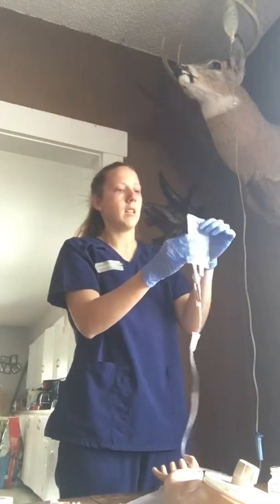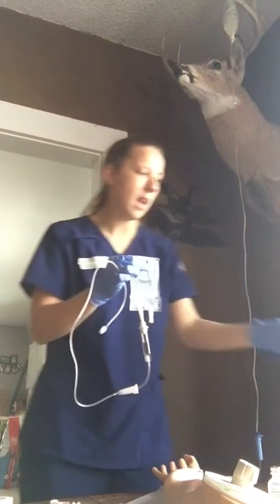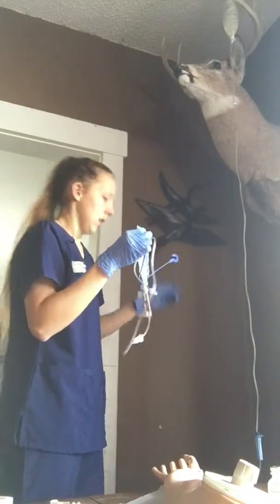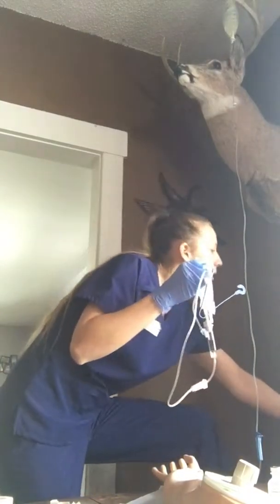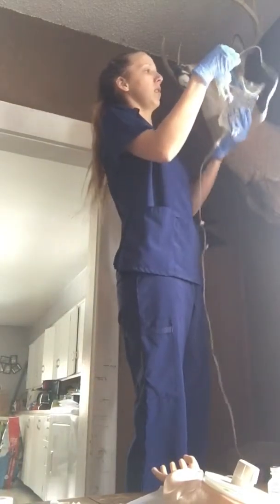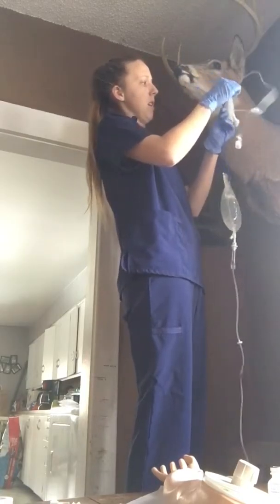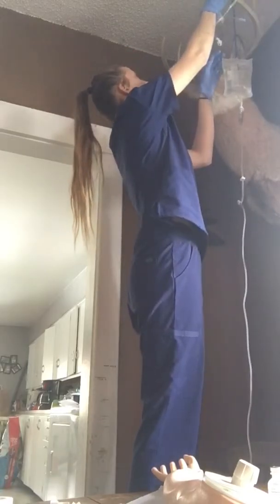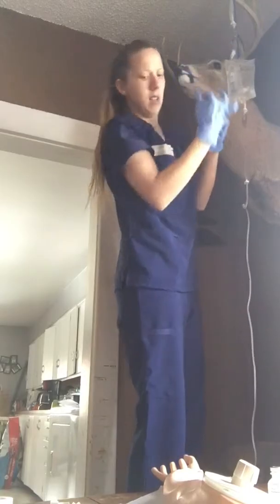Mrs. Ivy, here's the Dilaudid that Dr. Pinch ordered. I'm going to hang this and run it with the normal saline. I'm going to have our normal saline bag be lower, and then all the drip rates are going to be the same. Let me hang this.